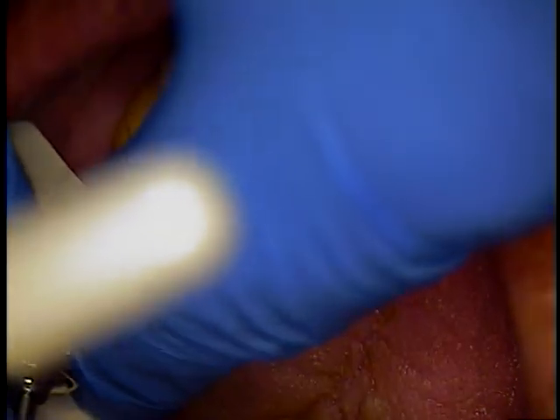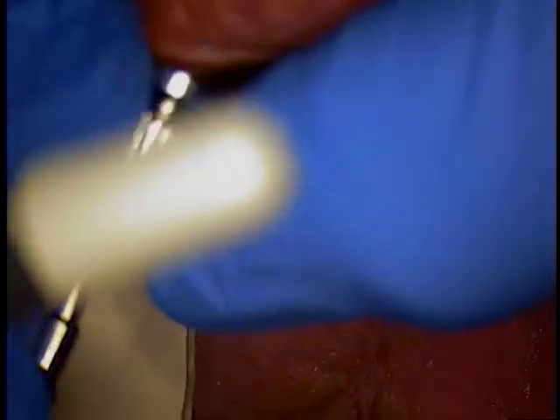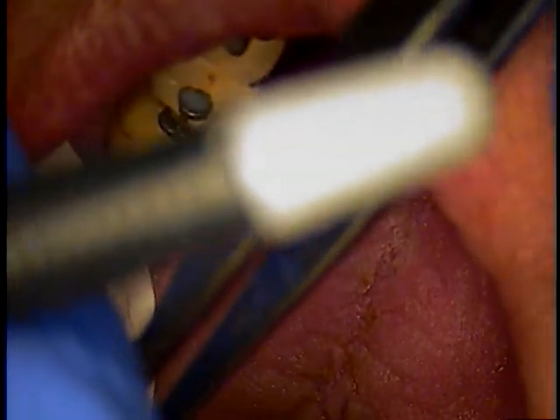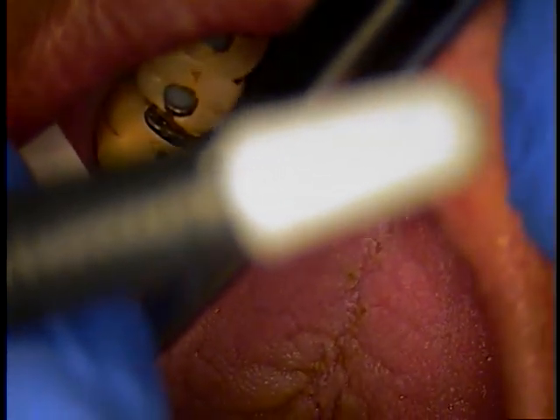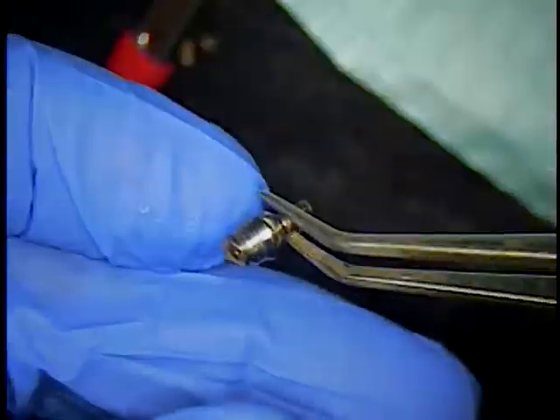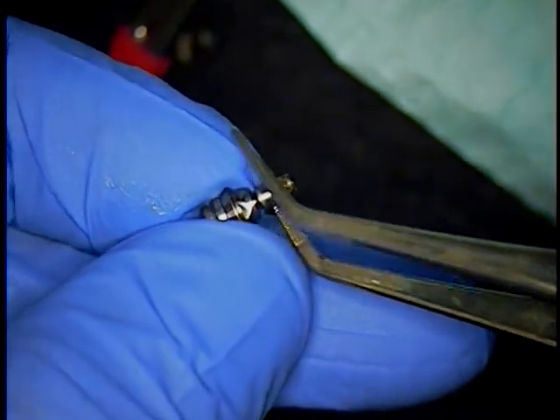This is number 14. Okay. Suction is on. Here it comes. Now I'll take some more photographs of this, but this is what's coming out of 14. And that, ladies and gentlemen, is a fractured implant.